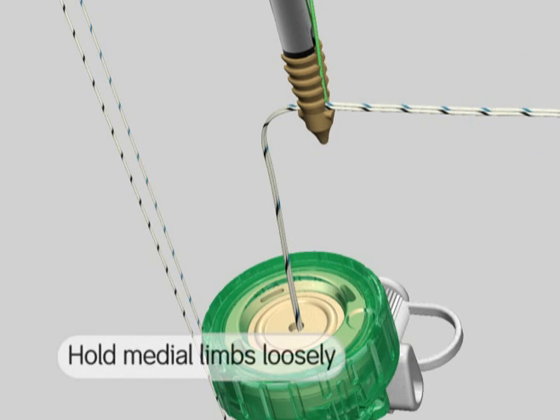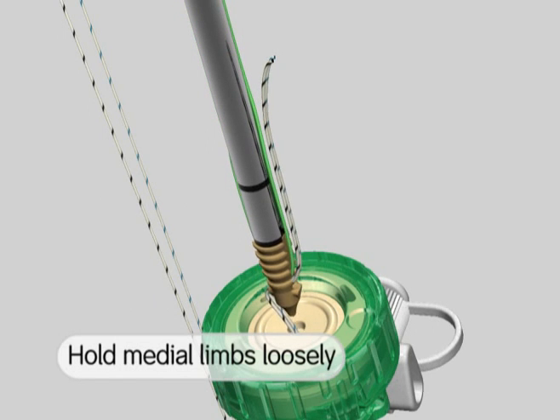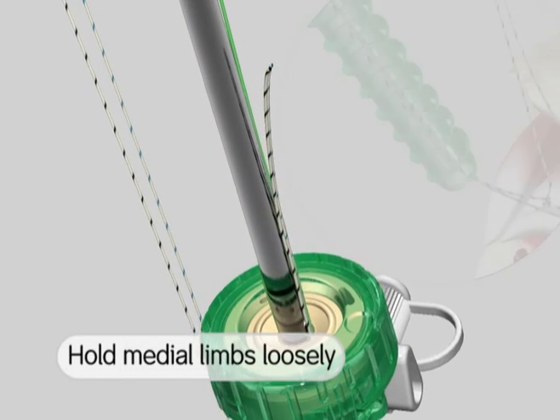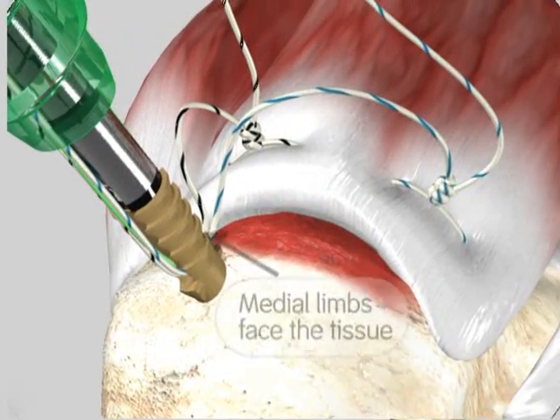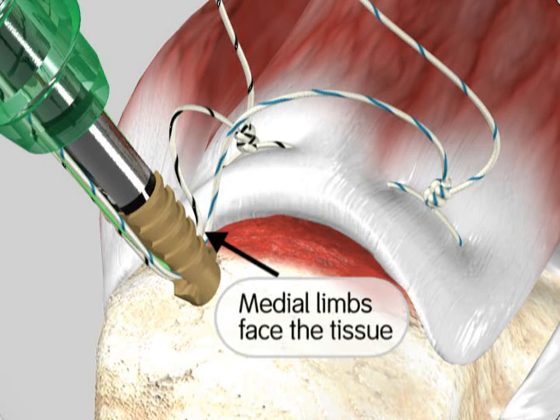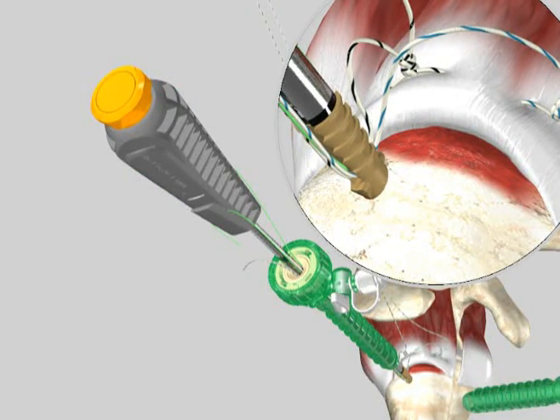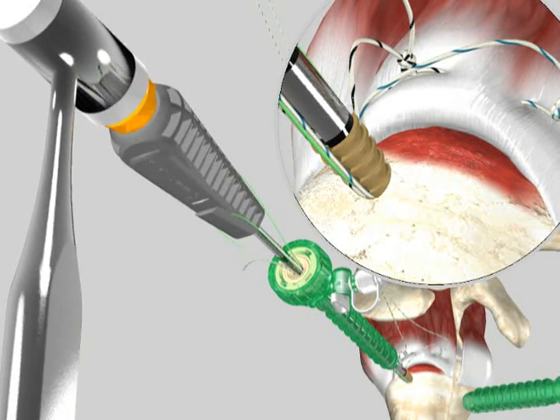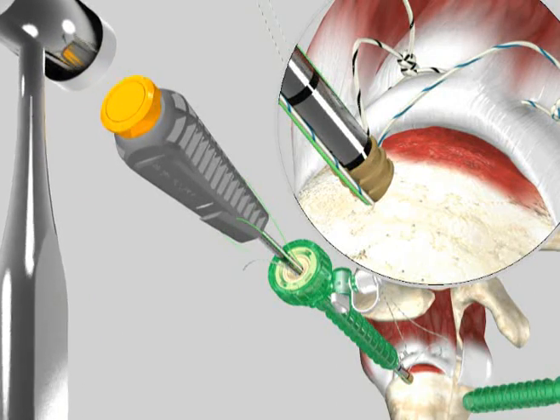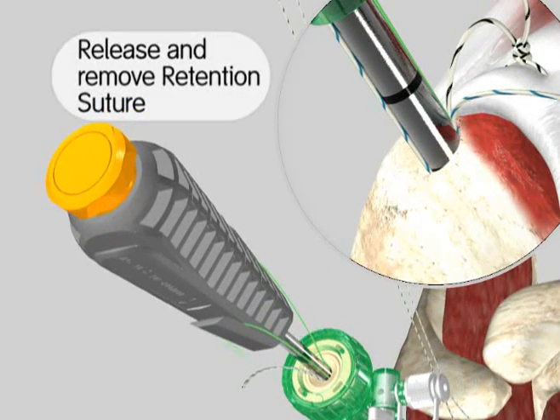While keeping some slack in the free medial suture limbs, advance the anchor into the joint towards the prepared hole. Orient the anchor such that the medial limbs entering the anchor face the tissue so the suture does not twist around the anchor. Use a mallet to tap the anchor into place until it is sitting one millimeter below the bone surface. Once the anchor is implanted, the retention suture should be removed from the inserter handle and discarded.